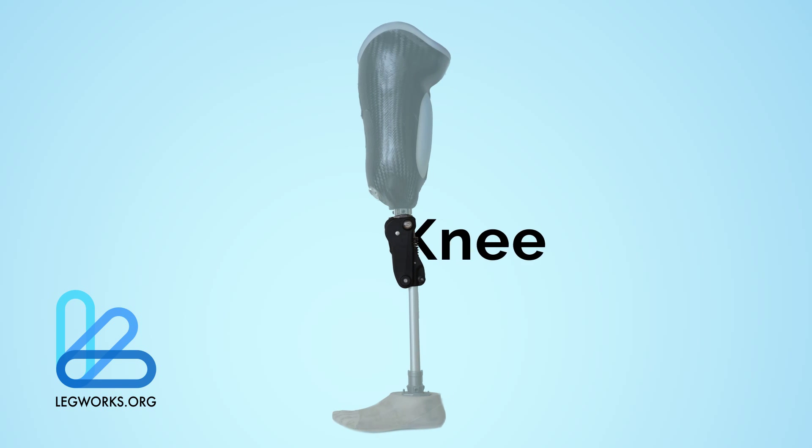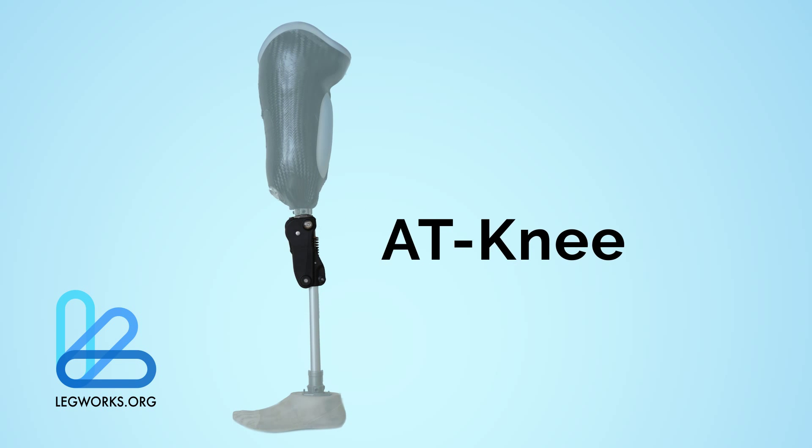Legworks is happy to introduce the All-Terrain Knee. The AT-Knee is an innovative mechanical knee joint, the result of a decade of research, product iteration, and clinical trials.